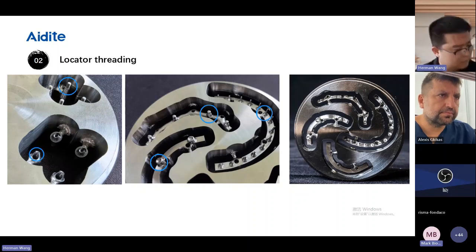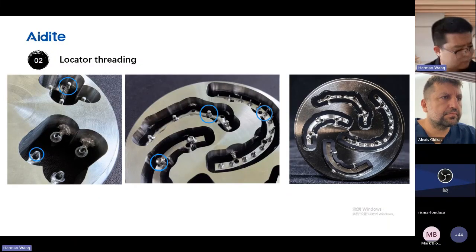Hi dear, Herman answers your questions that he would prefer to suggest you use WorkNC, because the WorkNC database is more fruitful and it's more applicable for this machine. Regarding HyperDent, if you have that, we have to check if the HyperDent function is suitable for this milling machine, because different machines have different requirements on software, so it still needs to be checked.